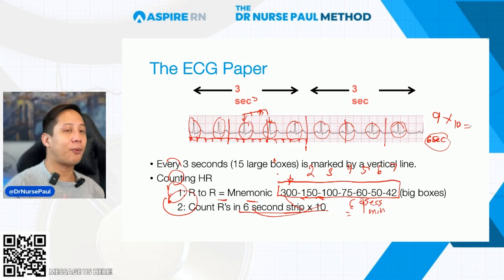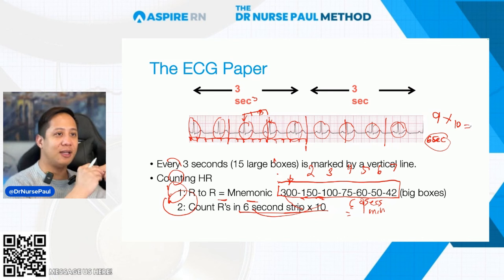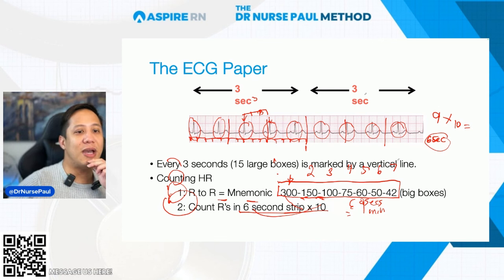It's only an approximation. In a hospital setup, you should have a telemetry connected to your pulse or EKG on the chest. It counts the heart rate more accurately. And if you look at your EKG report, at the top of the EKG report, guys, it says heart rate. Agree? Yes or no? Yes? But this is just to give you an overview because later, as we move along to the dysrhythmias, you have to know the rate.